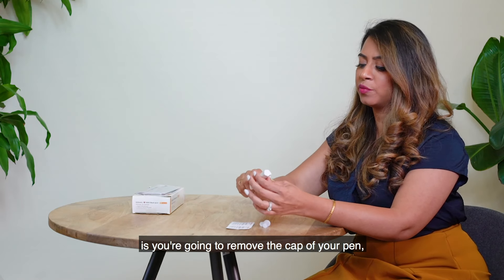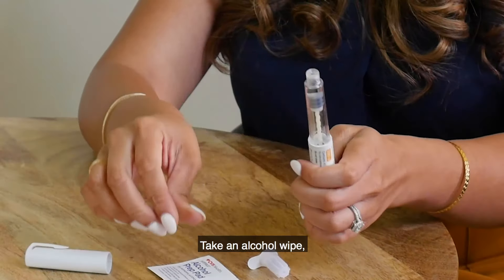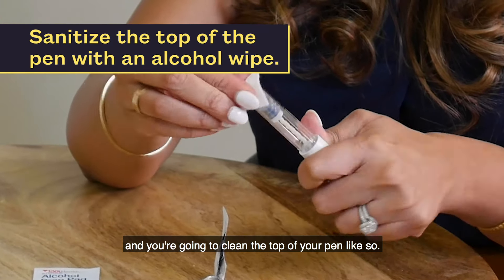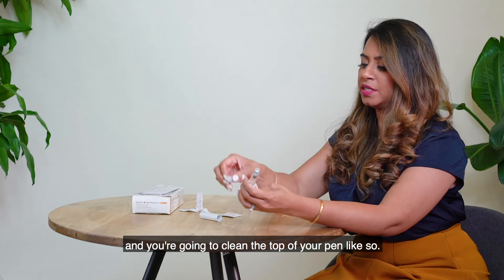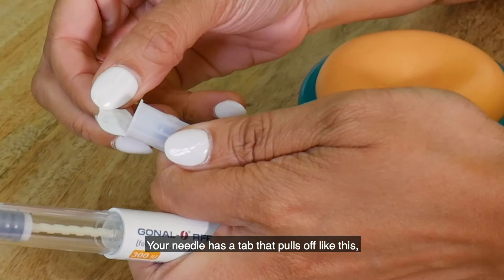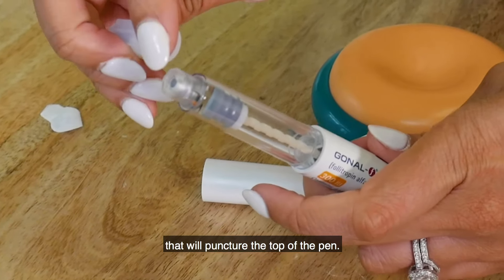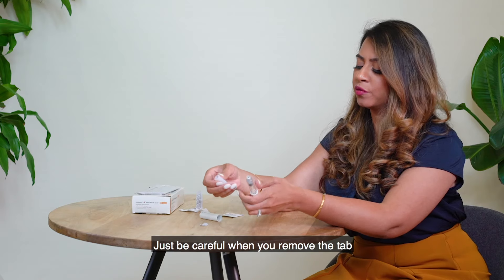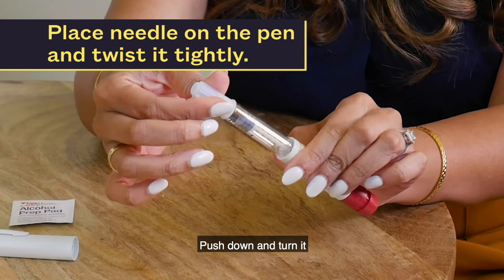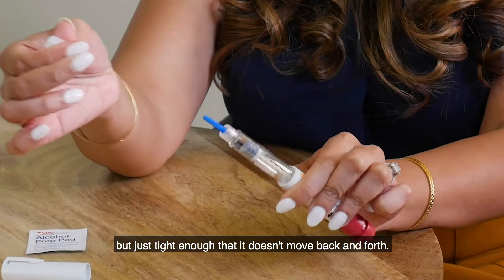What you're going to do is remove the cap of your pen — it comes off just like a regular pen. Take an alcohol wipe and clean the top of your pen like so. Place the needle on top of the pen. Your needle has a tab that pulls off like this, and on the inside there's another needle that will puncture the top of the pen. Just be careful when you remove the tab that you don't hurt yourself. Push down and turn it so that it's nice and tight — not too tight, but just tight enough that it doesn't move back and forth.